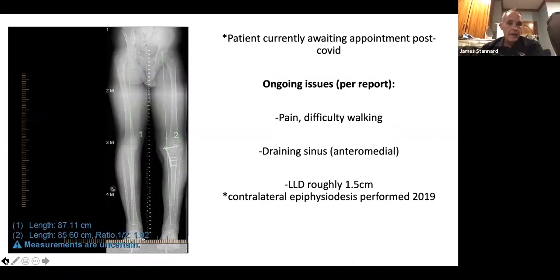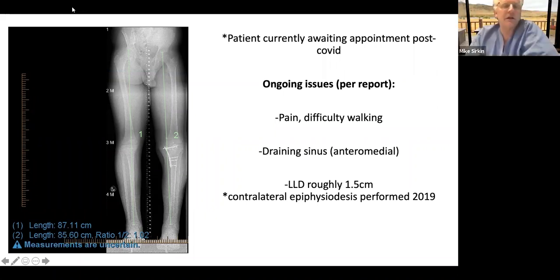Yeah, I was going to say, you want to go to your strength, and I'll bet you anything Mike is way better at doing an arthrotomy and getting the washout than I am. I don't feel like I see very well in there, but then I've gotten really used to using the scope. And the opposite's probably true, that I'm going to get a much better view with the scope because it's what I'm good at, and I'm not good at the open. I think that's a great point.